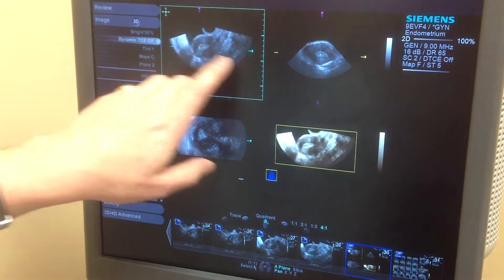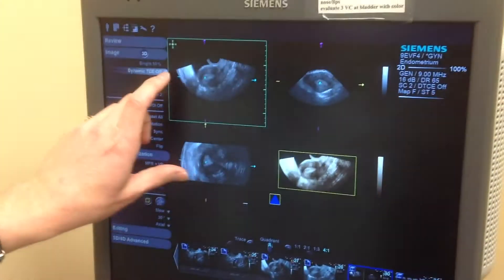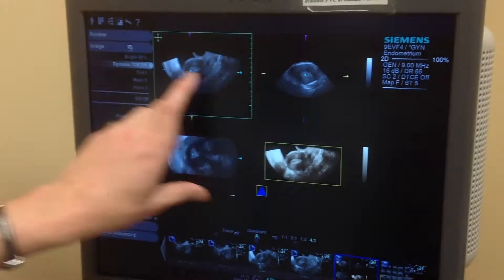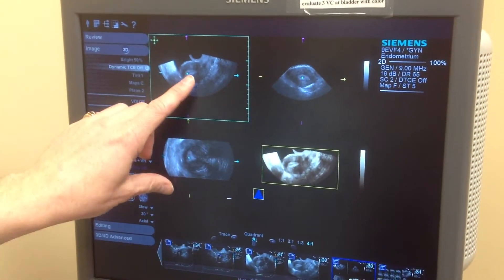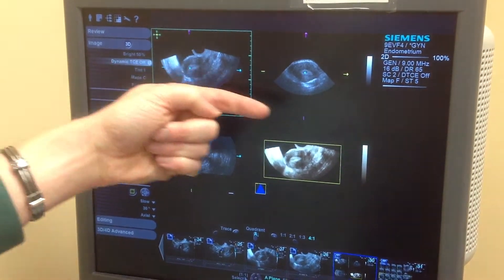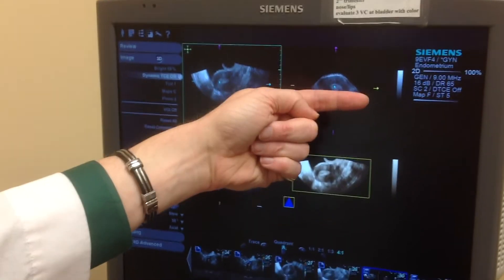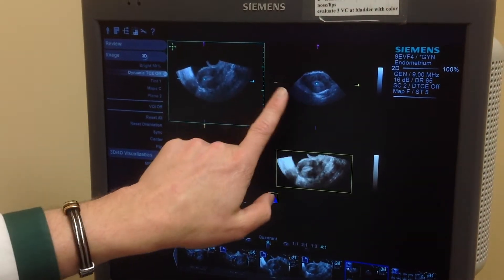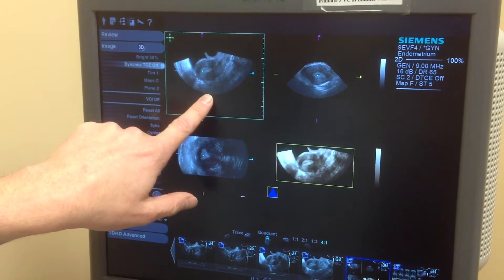Now I'm up in the fundus and I can see the nice slice of the transverse here. The coronal plane is here, and my goal with the reconstruction is to line up the endometrium parallel with that coronal plane. Looking over at the transverse image, I also want to make sure that's lined up in the transverse plane — this particular patient is pretty well lined up there, but we're going to rotate this one a little bit.